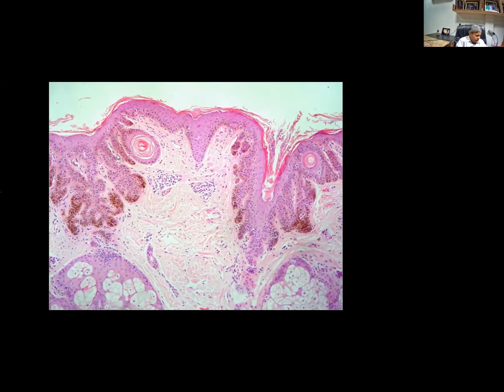And these follicles show very elongated, thinned out, branched, interconnecting rete ridges, what we refer to as the ram horn rete ridges, and there is increased pigmentation on the tips and the sides of these rete ridges, a feature which is very classic of Dowling-Degos disease. And so this histopathology was suggestive of a follicular Dowling-Degos disease.